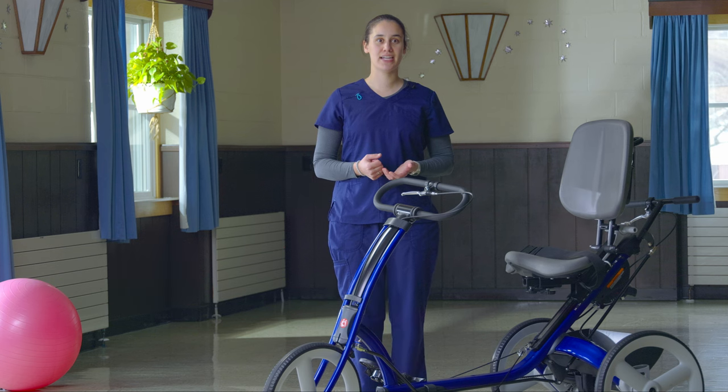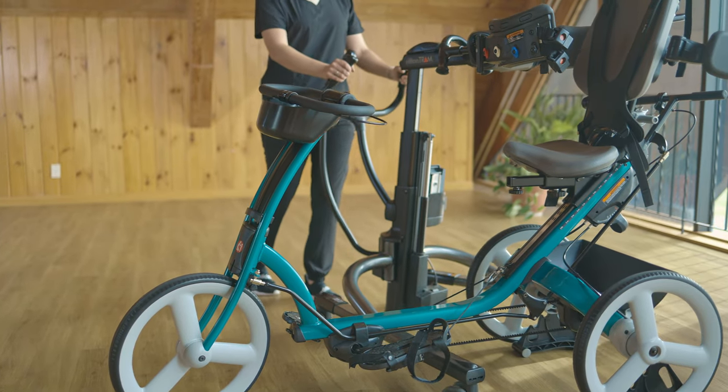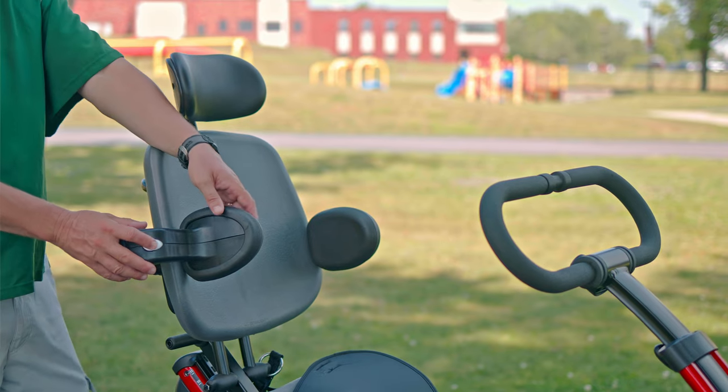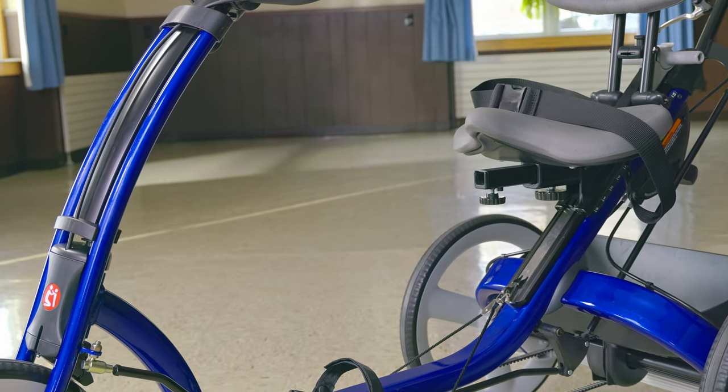You can also see that the center bar has enough clearance for a lift device, like the Rifton Tram, to roll right underneath. These laterals swing away for better access from the side, and the abductor comes off easily for leg clearance.